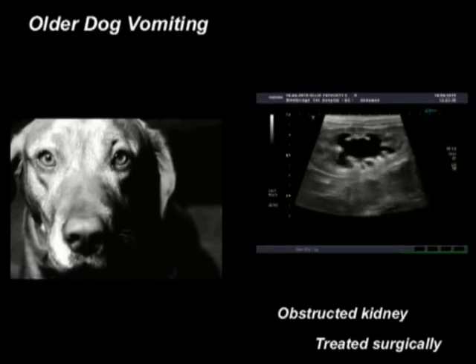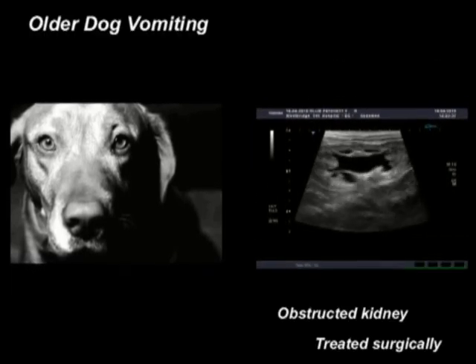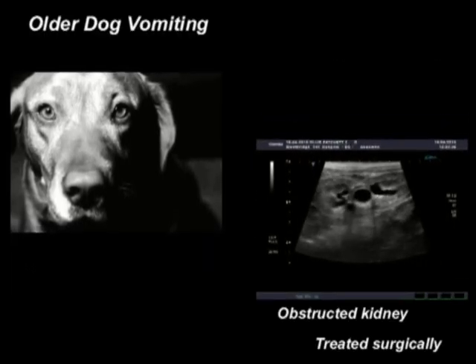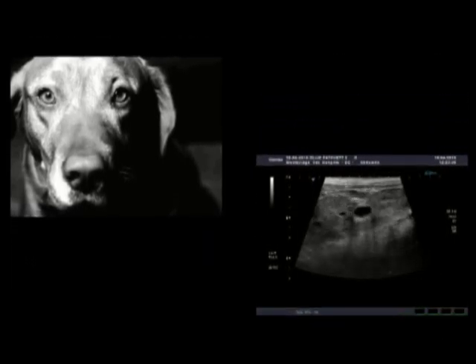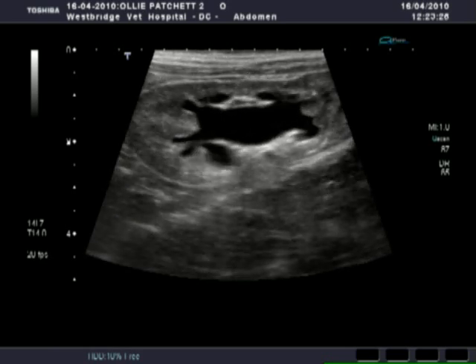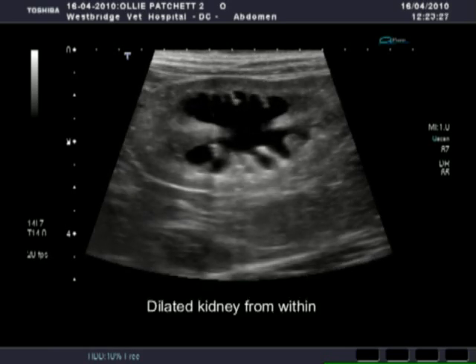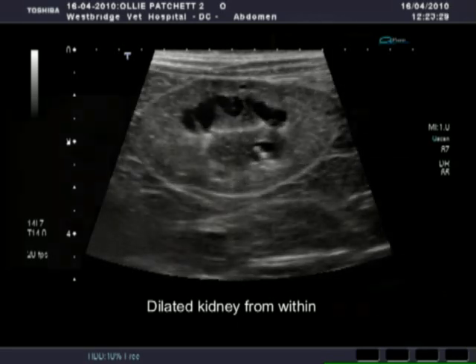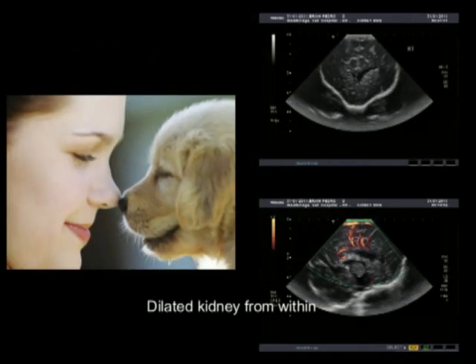An older dog was vomiting. Ultrasound showed that he actually had a stone blocking his ureter to his kidney. Here you can see how distended it was, not being able to drain properly.